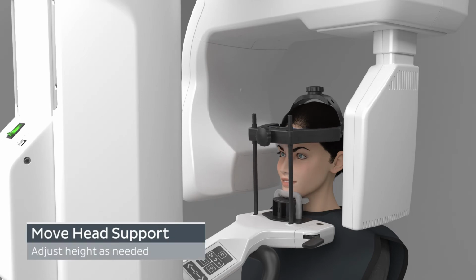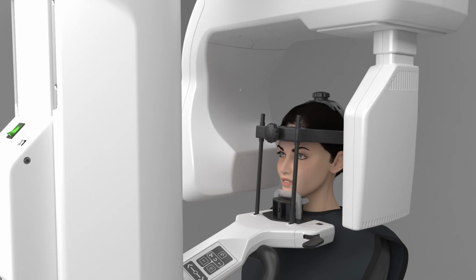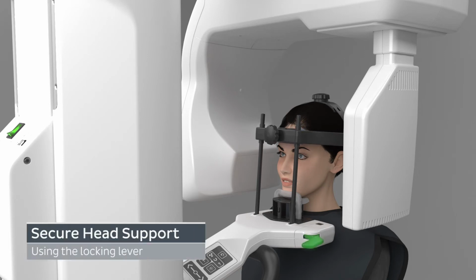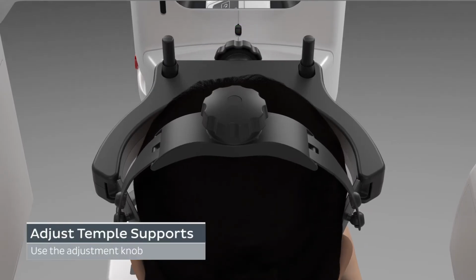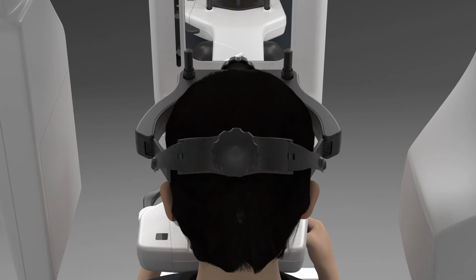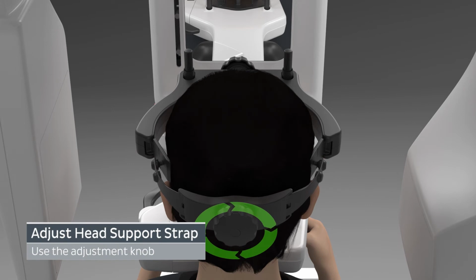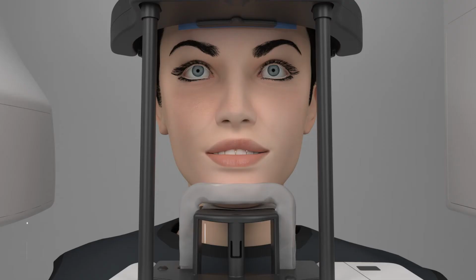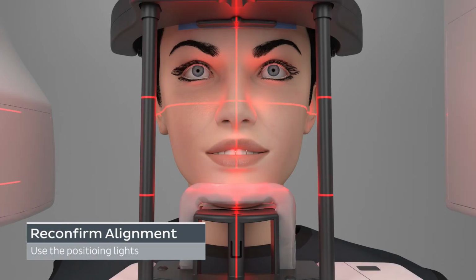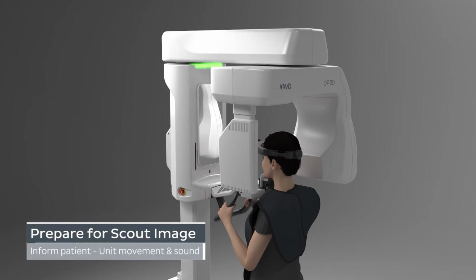Move the head support against the patient's forehead and adjust the height of the head support if needed. When complete, lock the head support using the locking lever. Adjust the temple supports using the adjustment knob and pivot the head support strap behind the patient's head. Tighten the head support strap using the adjustment knob to minimize patient movement. Reconfirm proper patient alignment using the positioning lights. You are now ready to acquire a Scout image.